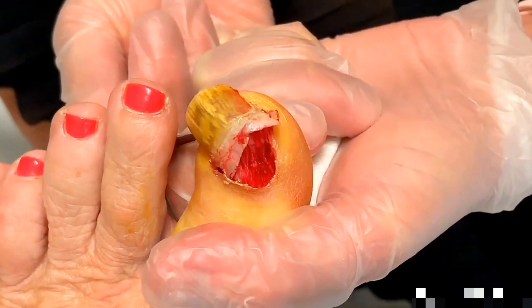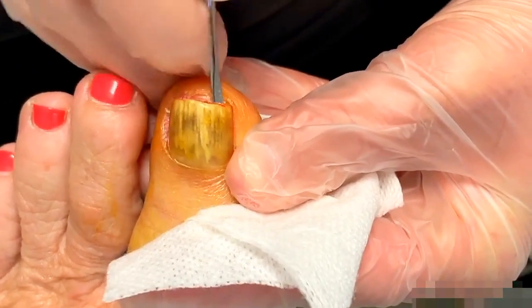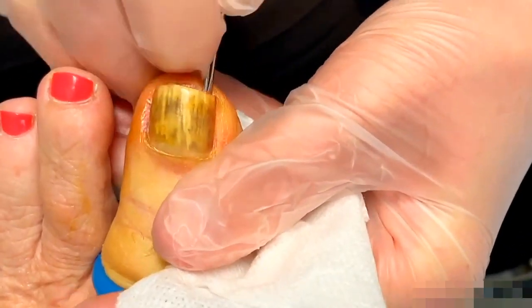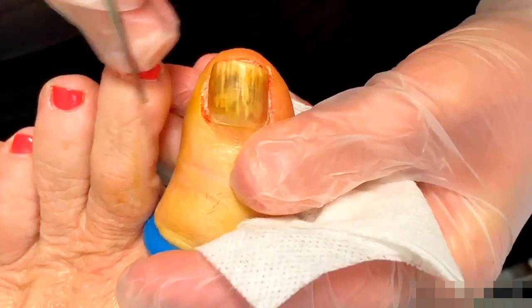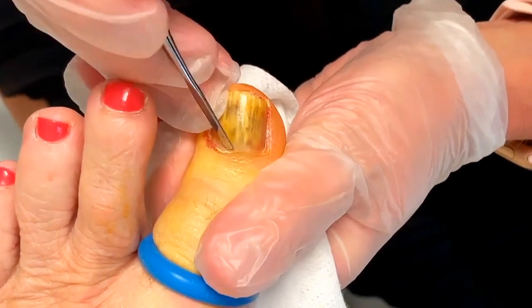As you can see, if you freed everything successfully, don't be too aggressive because it damages the tissue and it takes longer for it to heal. So just, if you're a resident or a student studying, just be really gentle with the tissue. It doesn't need to be barbaric.